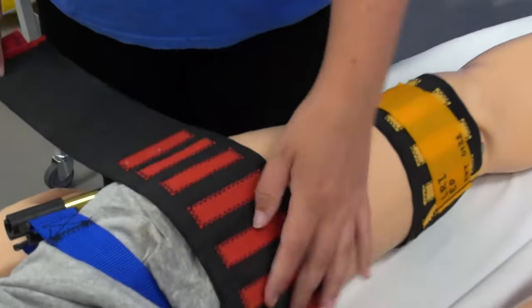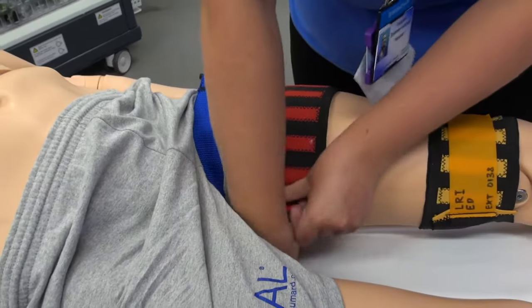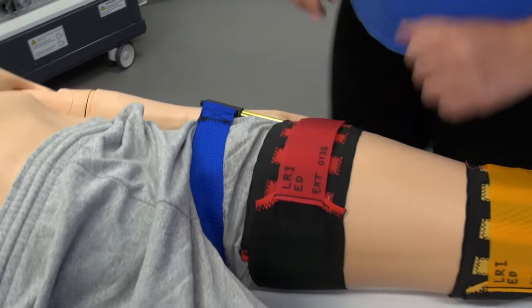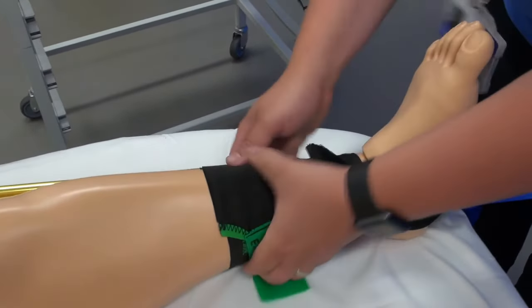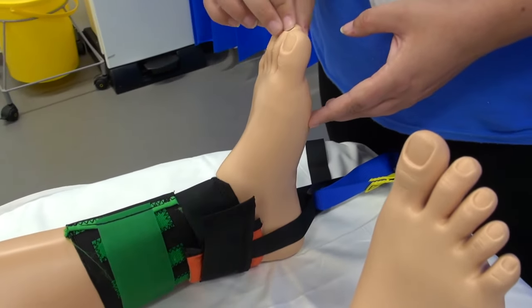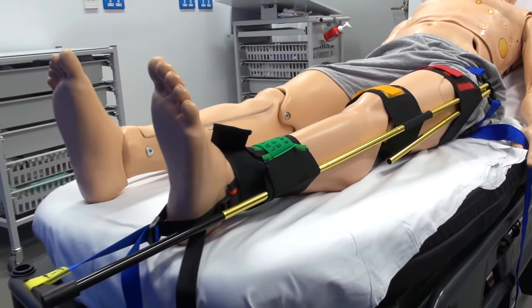Attach the elastic thigh strap and finally attach the elastic ankle strap. After applying the Kendrick Traction Device, check the patient's neurovascular status in that limb again. You'll then be left with the traffic light system: red, amber, green.